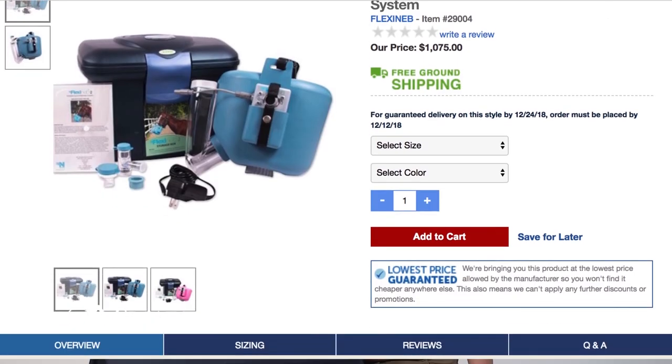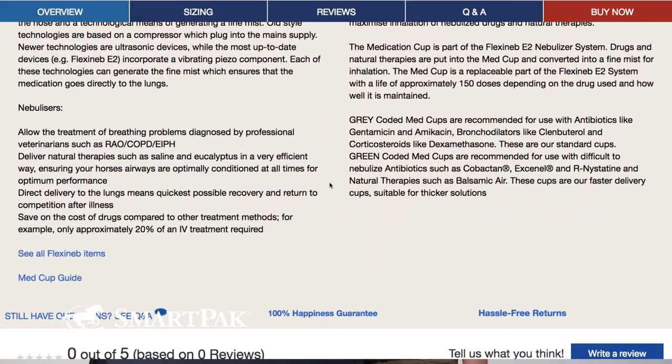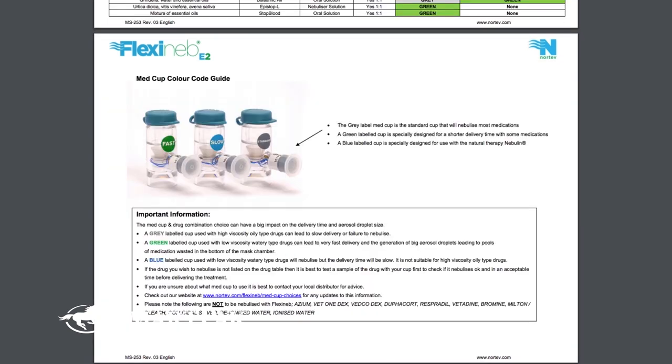The nebulizer also comes with distilled water, which you will use to clean the nebulizer. If you are unsure which flow cup you should be using for your horse's medication, you can just check out the chart on our website.